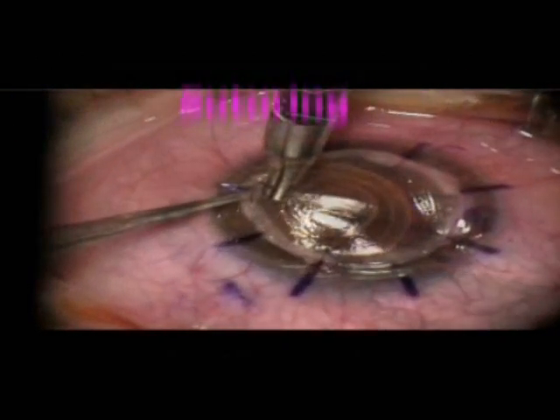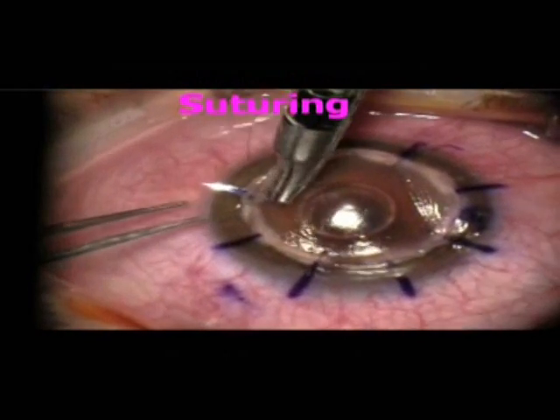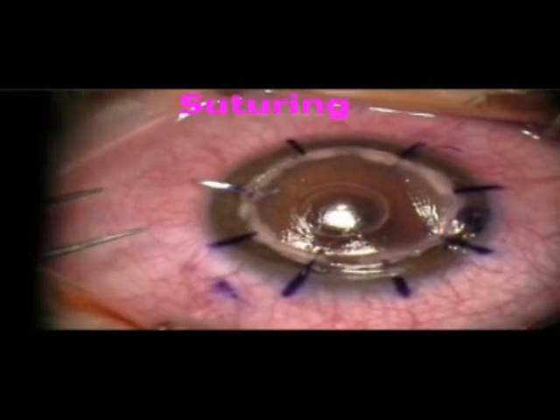We suture the donor cornea without the descemet and make it in the regular way.